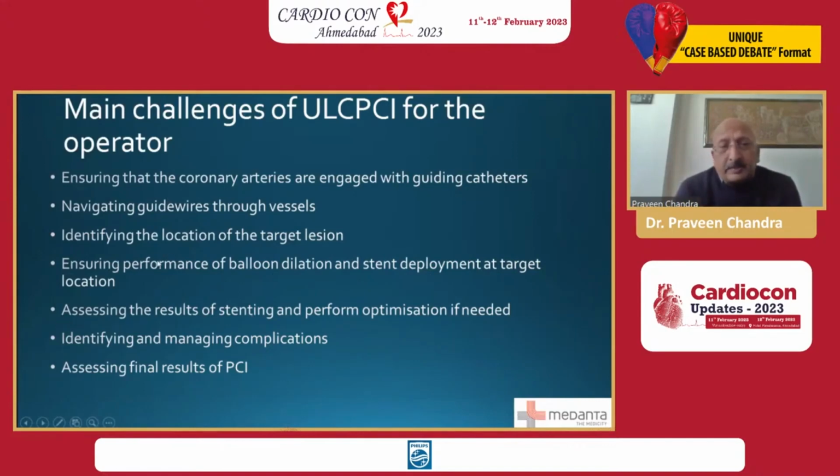For all these steps, there is no contrast used. And the final assessment of stenting, looking for complications and managing them, is all assisted by imaging and physiology.